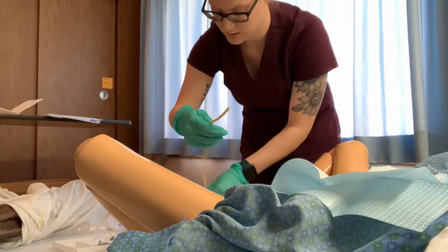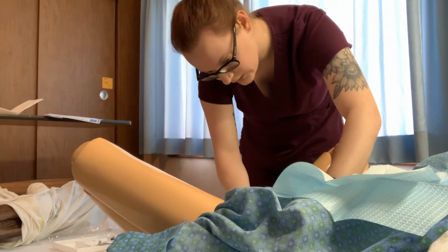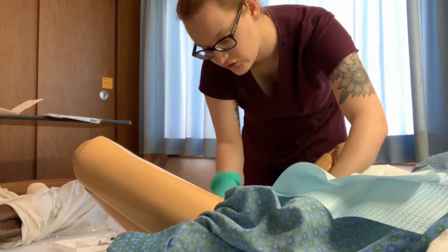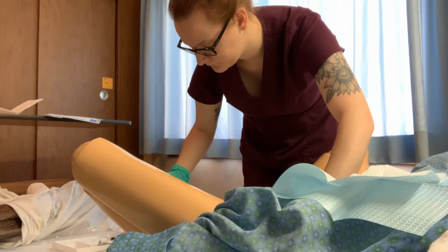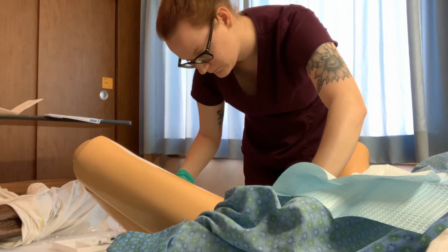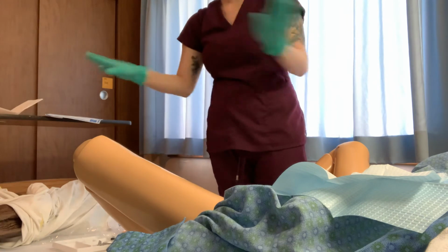And okay, Edna, I'm going to spread the labia, and I have the catheter. Take a deep breath, and you'll push it in until you don't feel any resistance, which is probably about a few inches. And then you'll inflate the balloon. Okay. And it's inserted. And you'll tug a little bit to make sure that it's in. And then you'll clean up and discard.